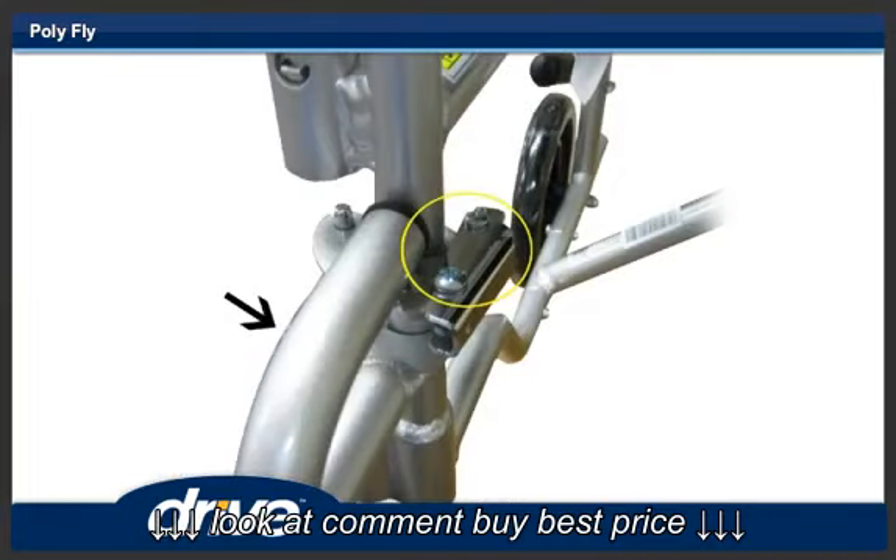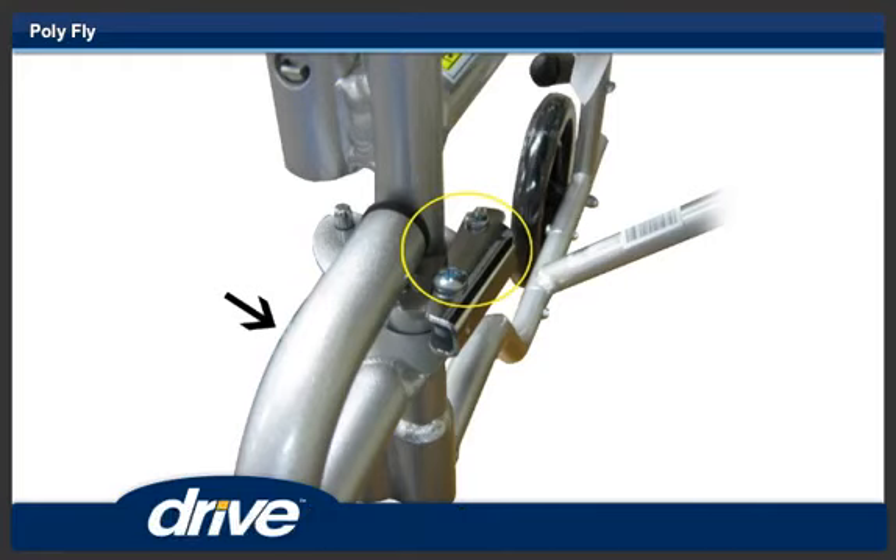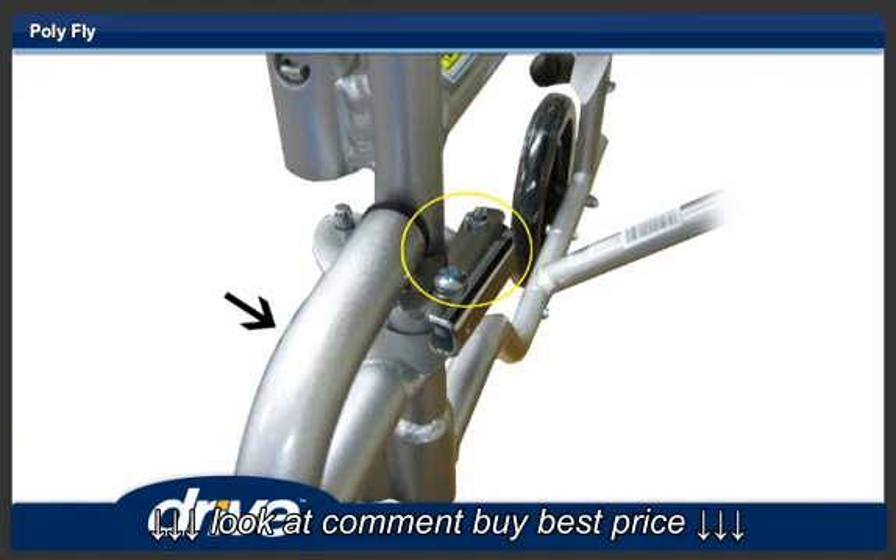Step 6. Swing the footrest towards the middle of the Polyfly until it locks into place. Repeat steps 5 and 6 for the other footrest.